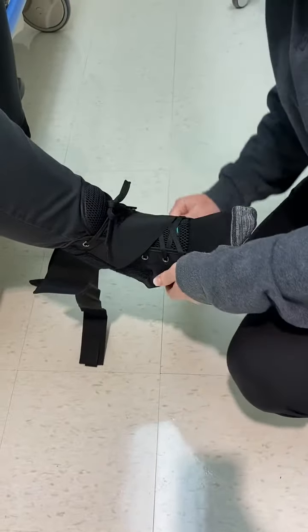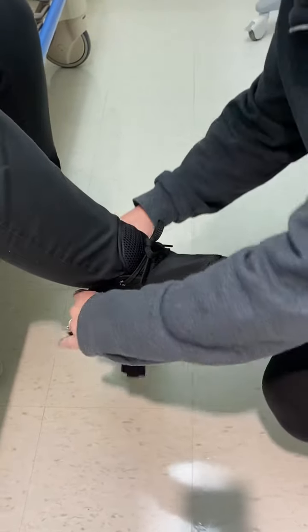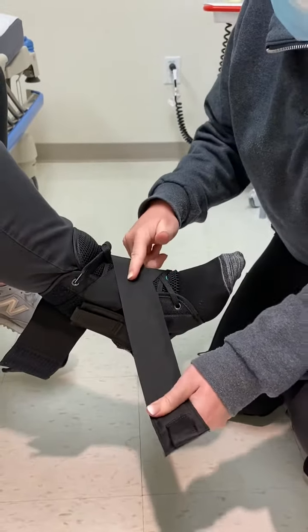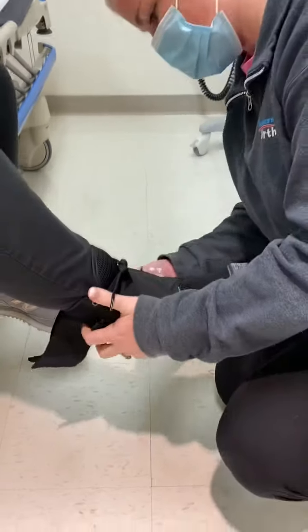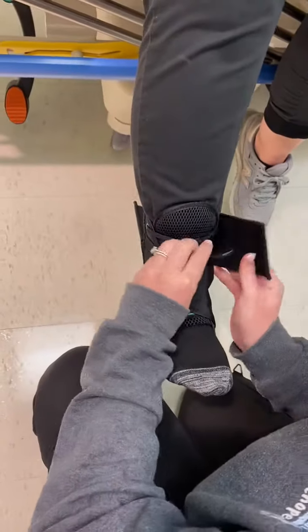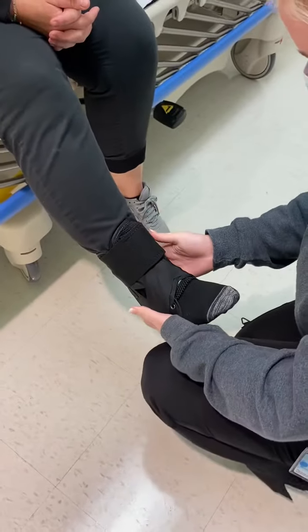Once you have it tied, take the straps — they're gonna come across the front, come under the heel, hug under there, and then come right up on this velcro strap. The other strap is gonna do the same thing: make an X in the front, come under the heel, and come right up on the velcro strap on this side. This last piece locks everything in.